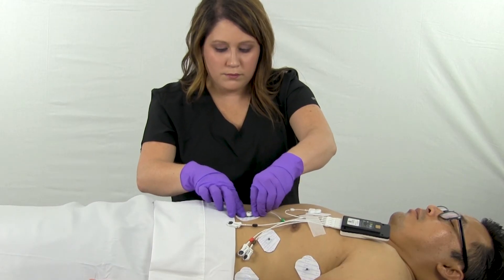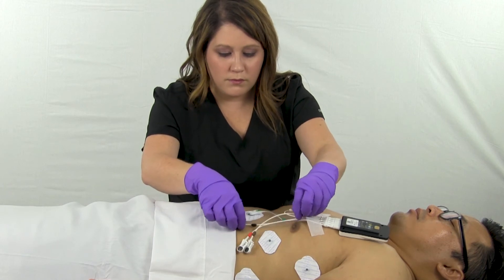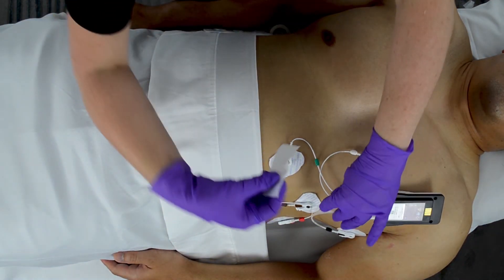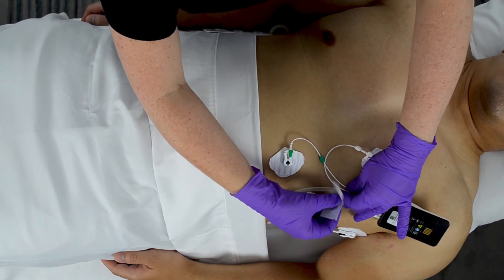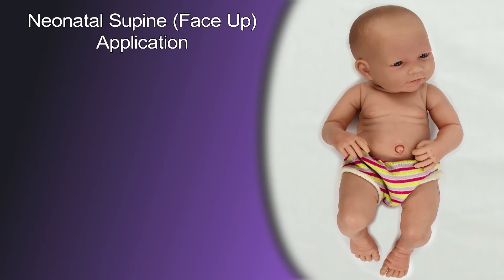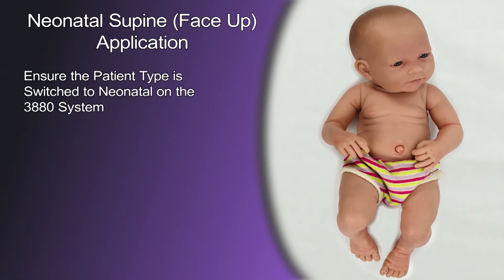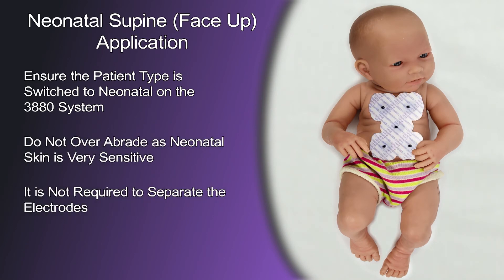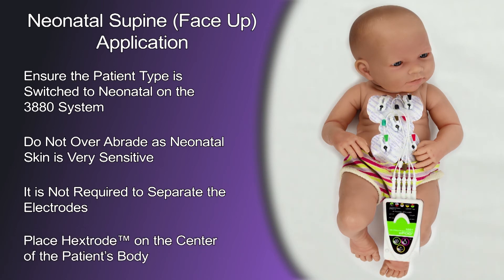Place the EPOD near the patient's abdomen or their left shoulder. If the EPOD is resting on the patient's skin, it is recommended to place gauze pads or a wash cloth under it to avoid any wireless signal disruptions. For neonatal patients, first ensure the patient type has been switched to neonatal. Do not overabrade as neonatal skin is very sensitive. It is not required to separate the electrodes. Finally, place the Hextrode on the center of the patient's body.